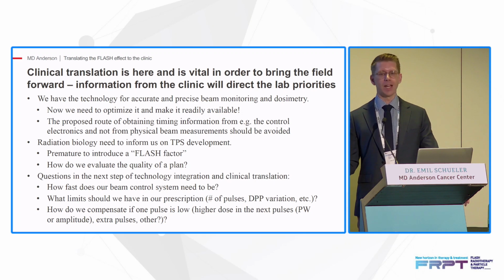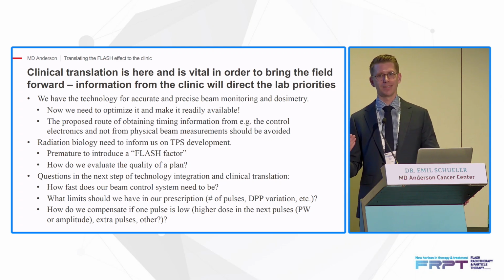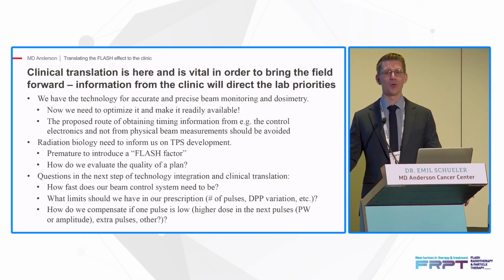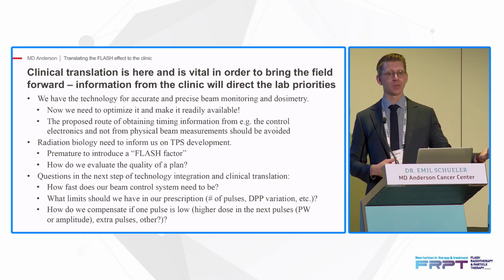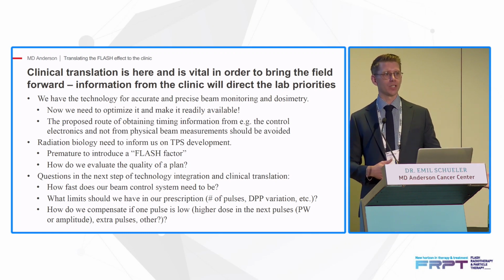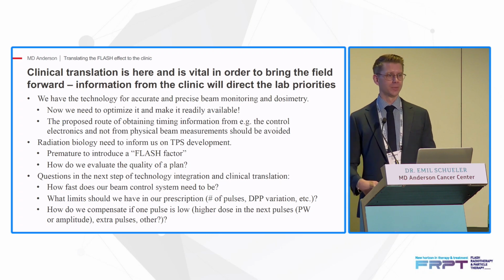Introducing a FLASH factor, I think, is very premature in this setting, because we actually don't know what even the magnitude of the FLASH effect is in different tissues, in different settings. And what I always ask as well is, if I have all of these metrics in my treatment planning system, I still don't know from a clinical perspective what is a good plan or not.